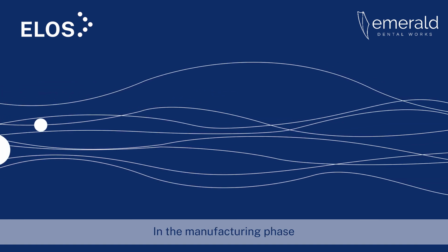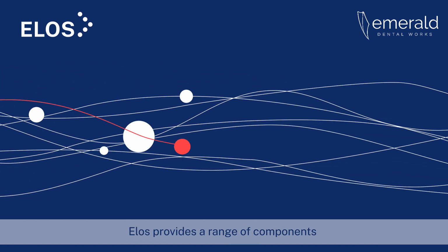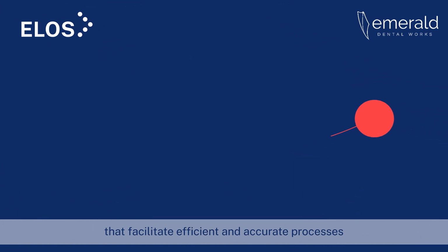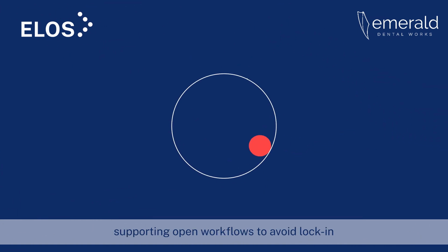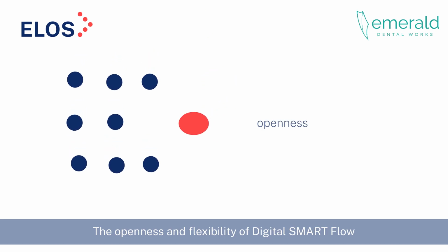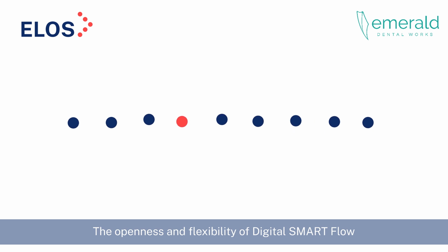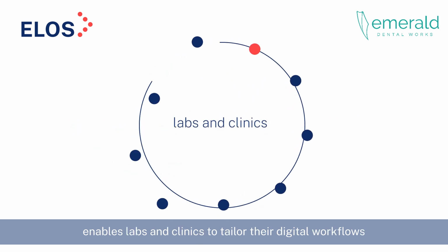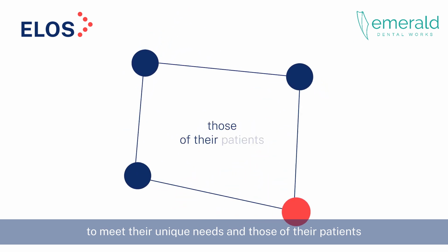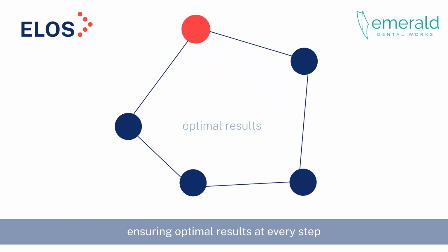In the manufacturing phase, Elos provides a range of components that facilitate efficient and accurate processes, supporting open workflows to avoid lock-in to proprietary systems or providers. The openness and flexibility of Digital SmartFlow enables labs and clinics to tailor their digital workflows to meet their unique needs and those of their patients, ensuring optimal results at every step.